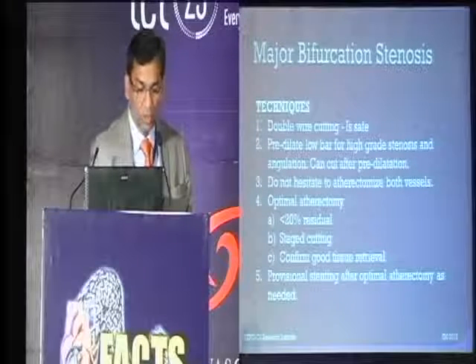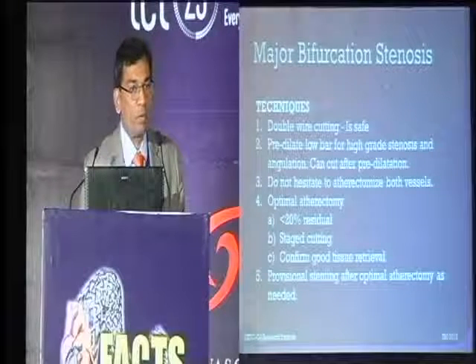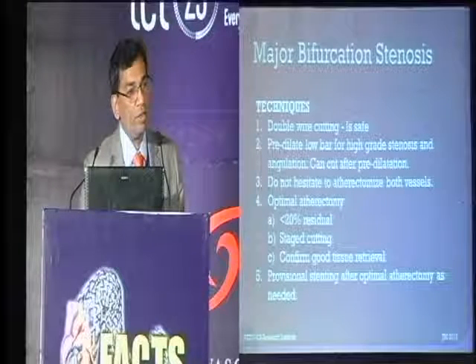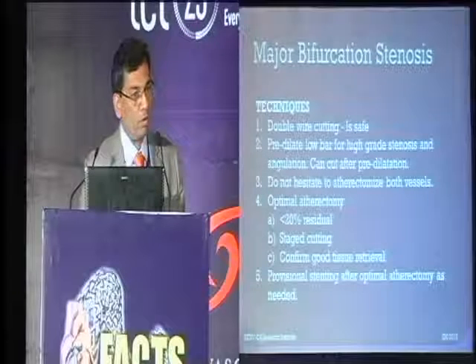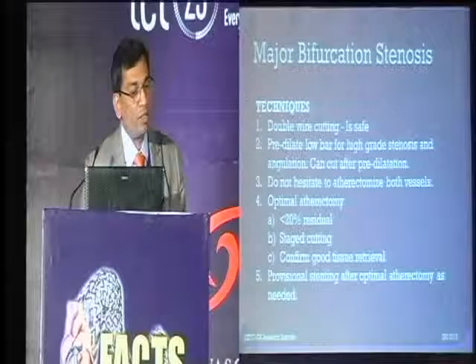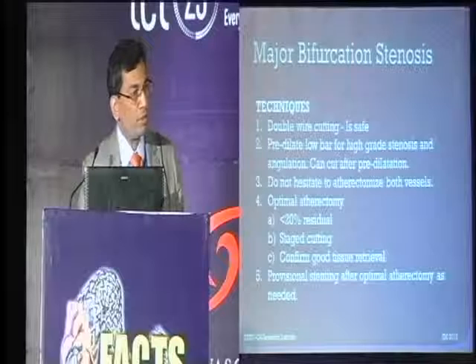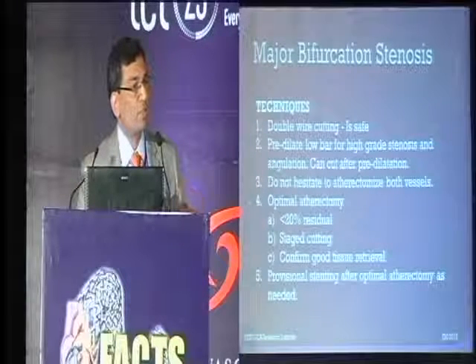The key about atherectomy is to commit yourself to use the device to the optimal extent. Optimal atherectomy is key to long-term success if you have to use atherectomy for coronary revascularization. If necessary, you might have to keep reassessing the lesion and go multiple cuts, piecemeal approach, till you get residual stenosis to less than 20%.